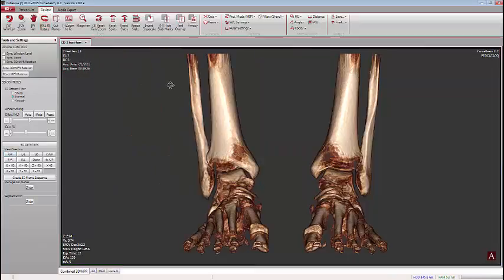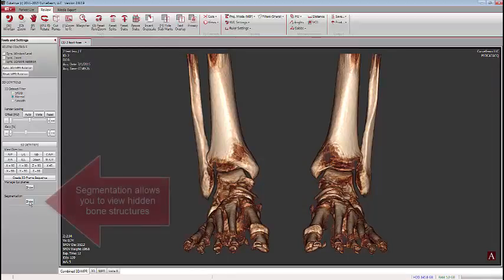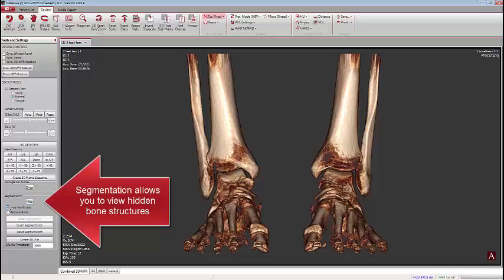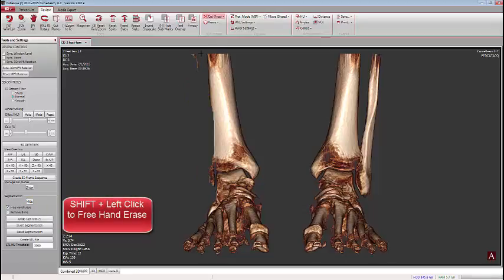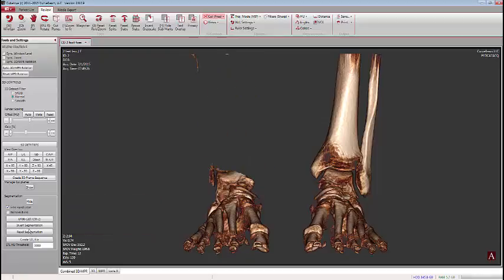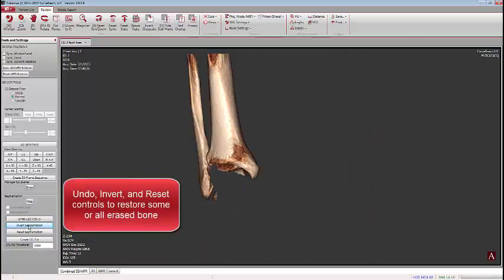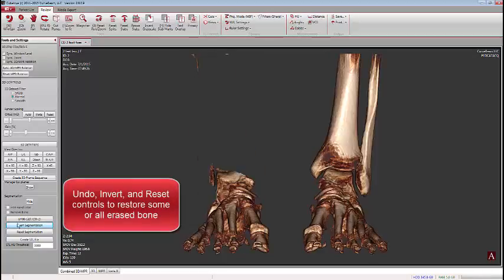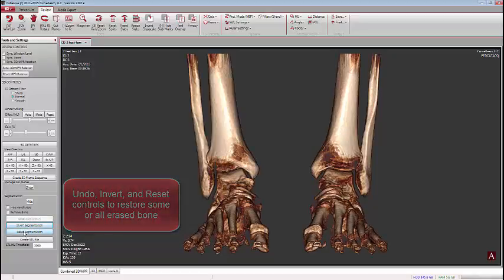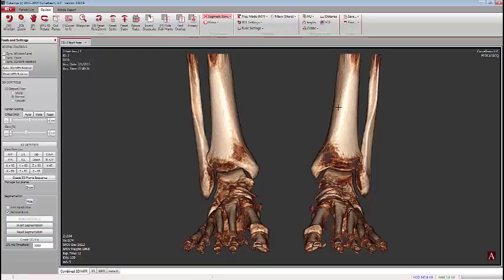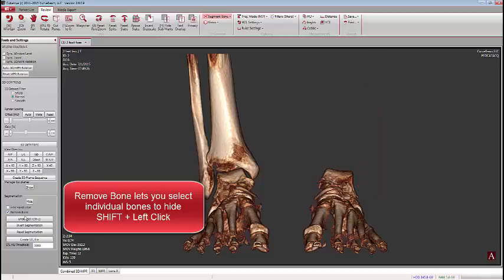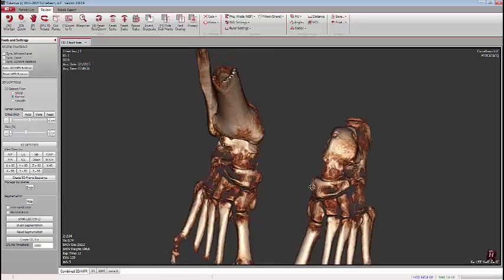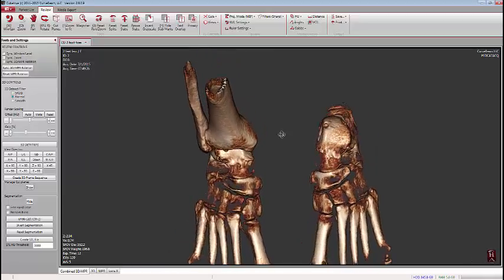New tools have also been added to better enable you to manipulate the 3D rendering. On the lower left-hand side, we'll show the segmentation tools. Selecting Freehand Erase allows us to draw around a bone or part of a bone to remove it from view. We can continue to remove multiple parts to isolate a particular bone, invert that segment to see what was removed, switch it back, and also reset the segmentation. Remove Bone enables you to one-click on a particular bone and remove it — we can do this multiple times to isolate and expose specific bones.